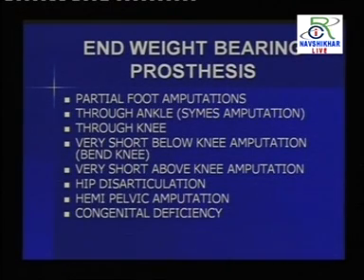So in this also, if the hip is disarticulated, and then after that we have a hemipelvectomy, means if part of the pelvis is also amputated, hip is amputated as well as part of the pelvis. In that case we have to fit a prosthesis for a hemipelvectomy, means we have to make a bucket and socket around the remaining stump of the body, and then fit a prosthesis of equal length to the other side to bear the body weight and to make the patient mobile. That is the ambulatory system.